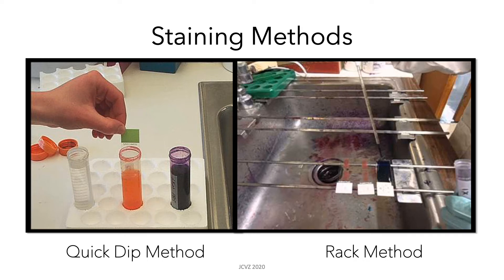Here you can see two staining methods that are commonly used in many hospitals. The first is the quick dip method, in which the slide is repeatedly submerged into the different stain components. On the other side, you can see the rack method, in which the slide is placed horizontally on a rack and is flooded with the different stain components.